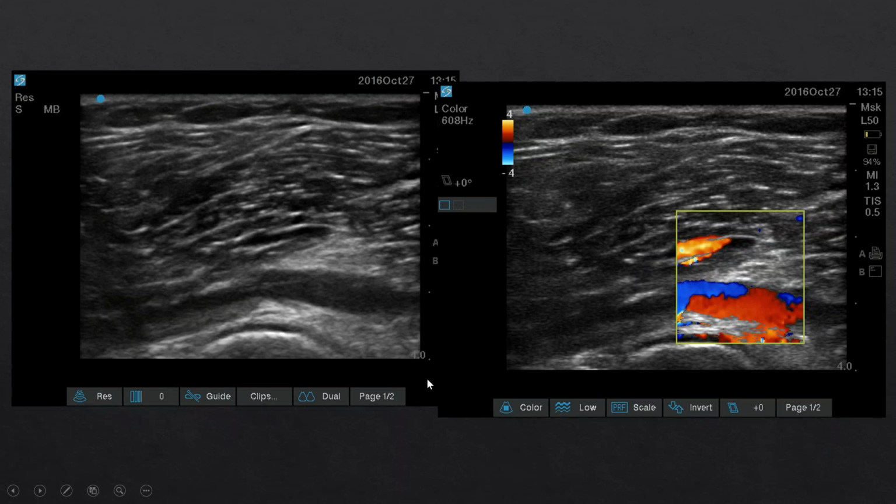and you have the ultrasound, you have the option of using the color Doppler, option of putting some pressure with the probe to obliterate these vessels, or go short and long, a little bit more proximal and distal to this structure.